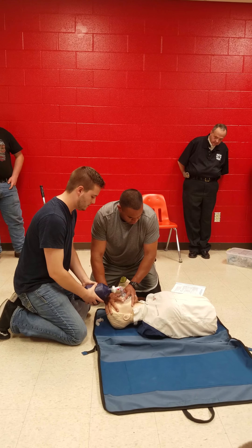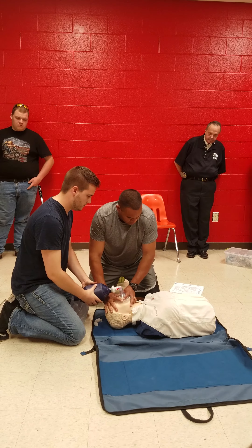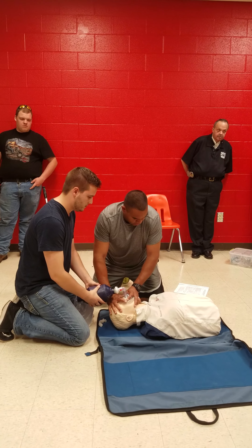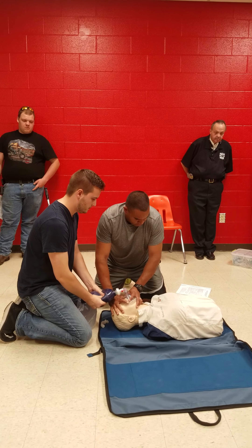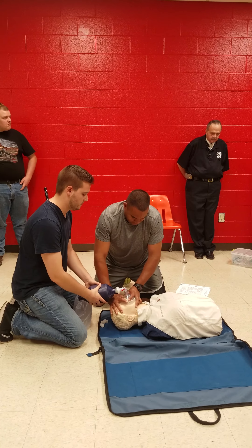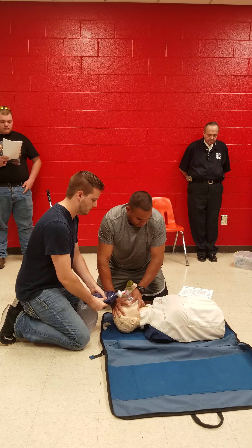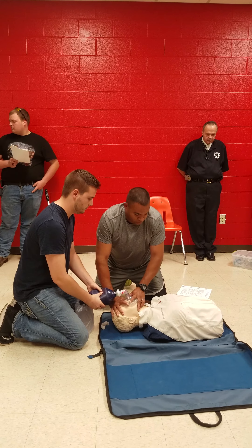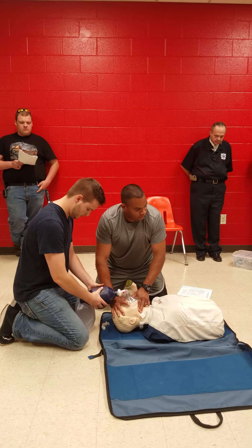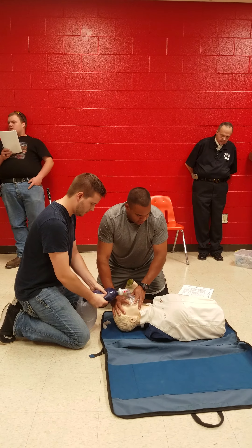Ventilate at five to six seconds. While he's doing this, Wayne is going to confirm: I'm looking for a visualized chest rise and fall. I'm going to check for spontaneous pulse. The evaluator is going to say both are present. After 30 seconds he's going to say okay, let's go.